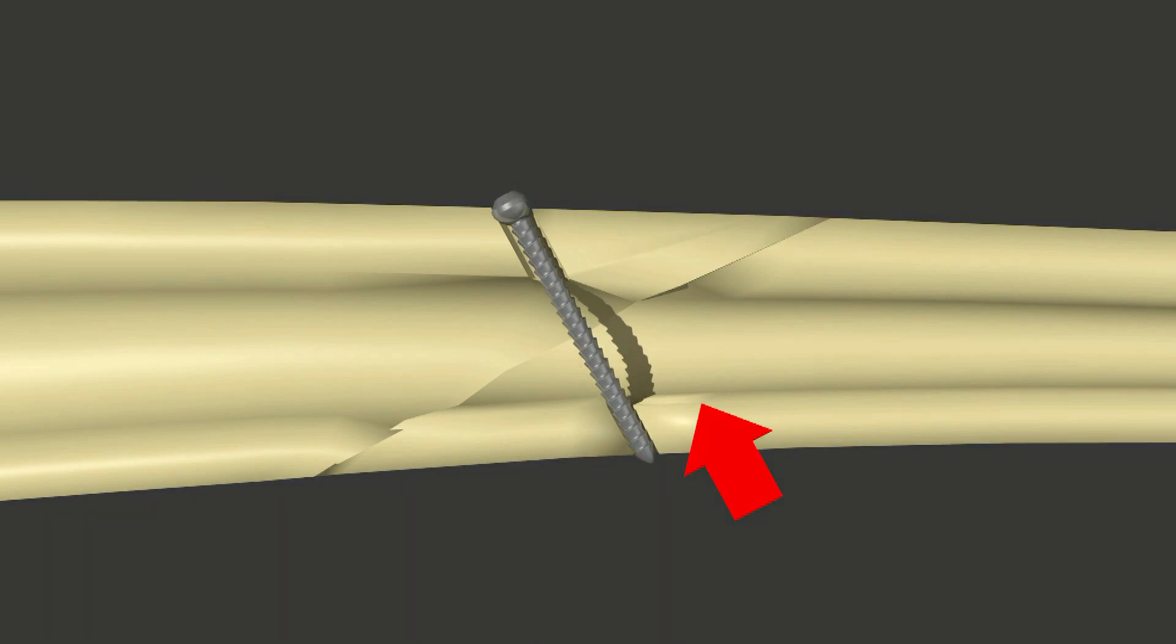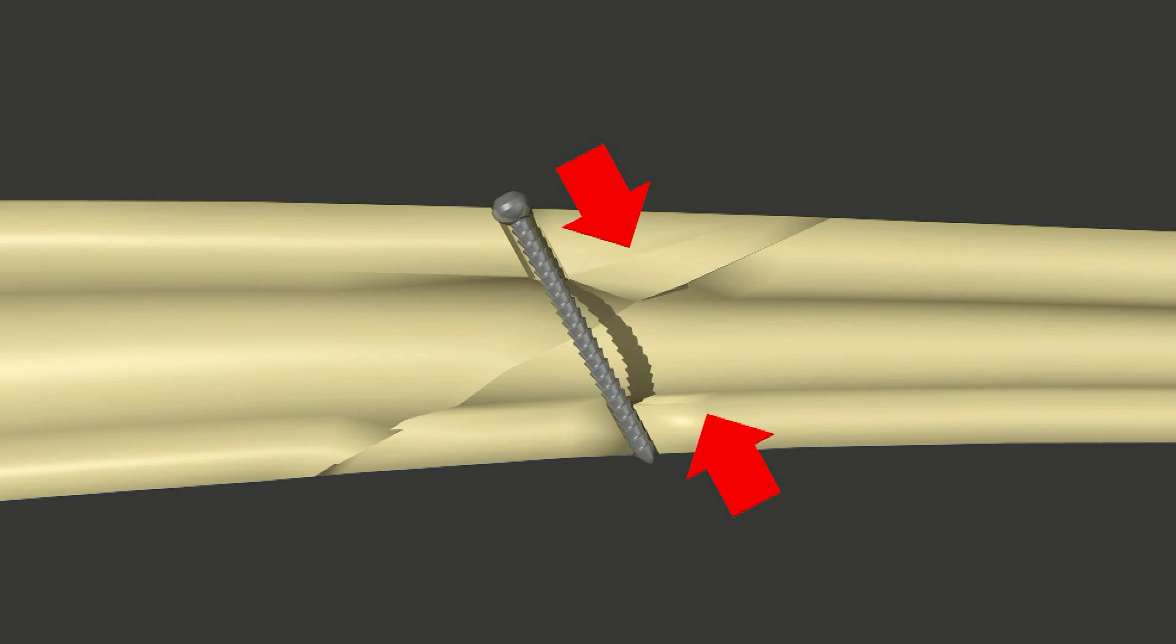The screw bites into the second cortex, pulling it up. The head of the screw presses against the first cortex, pushing it down. This compresses the two fragments together.